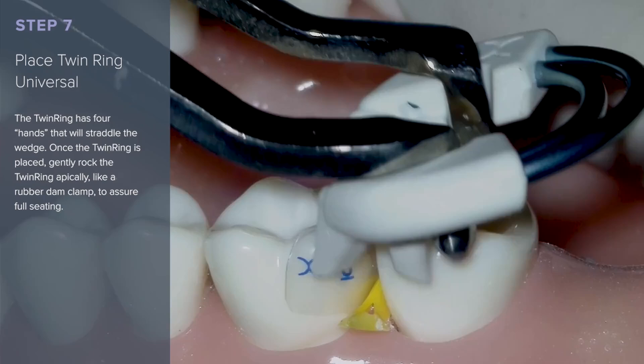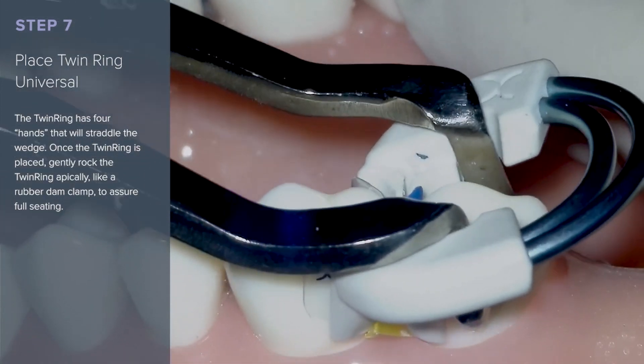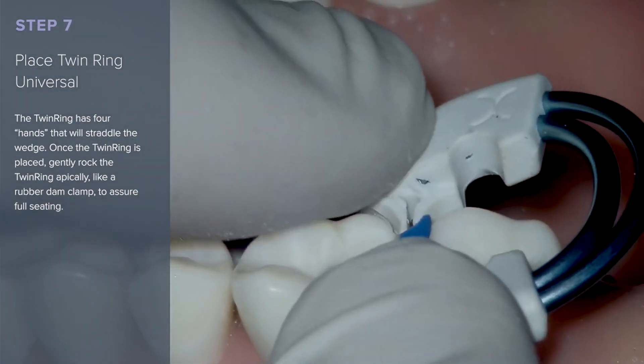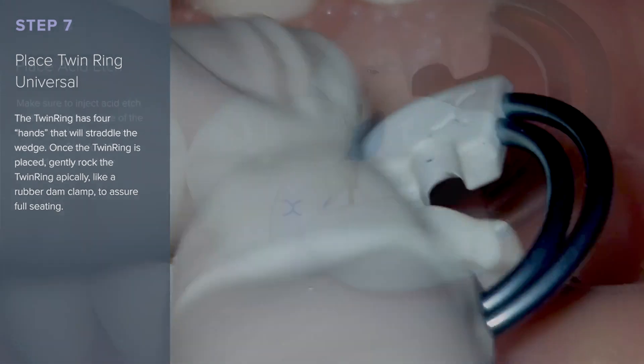Place the twin ring universal. The twin ring has four hands that will straddle the wedge. Once the twin ring is placed, gently rock it apically like a rubber dam clamp to assure full seating and full power.